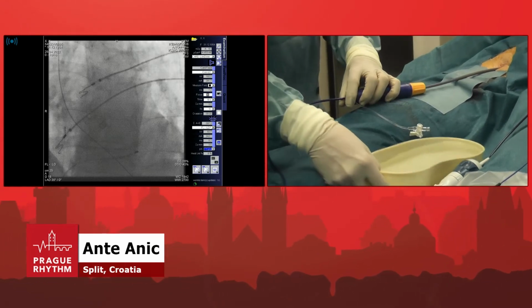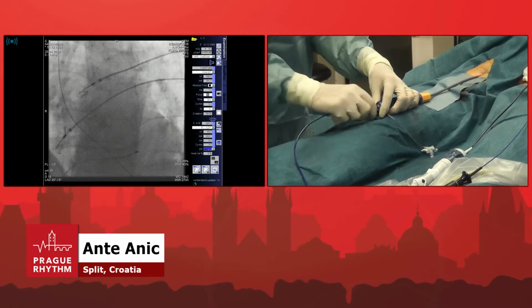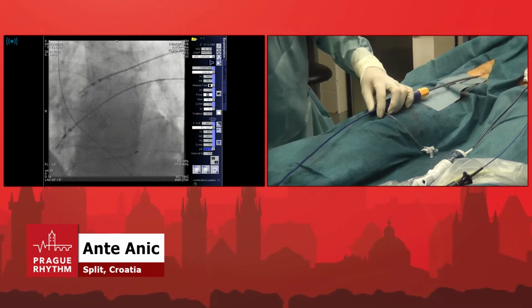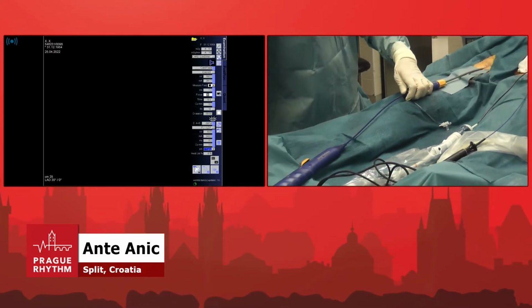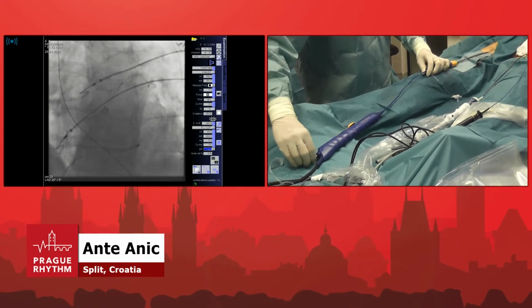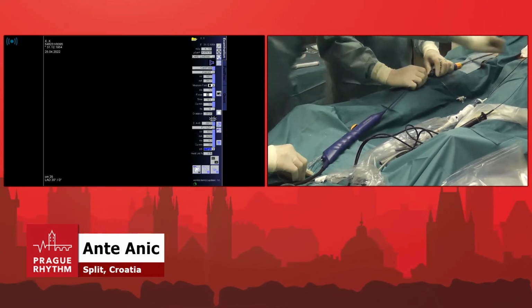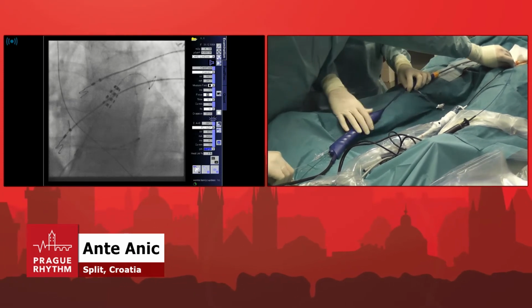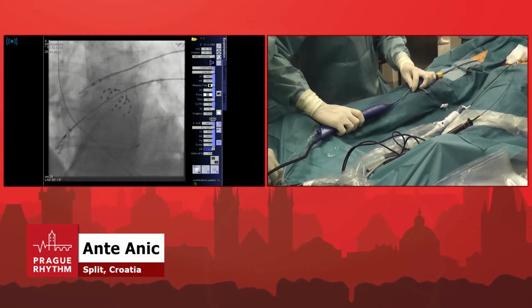Okay, Predrag, please, can you take this away? Okay, we are going up with the ablation catheter. Okay, can we turn the lights off a bit, please? Now, the idea, though we have a common trunk, we measured, isn't it? Okay, yeah. Here. So let's stay there, please hold the wire. So our idea is to go there, and we're going to try, okay, let me go in a basket.